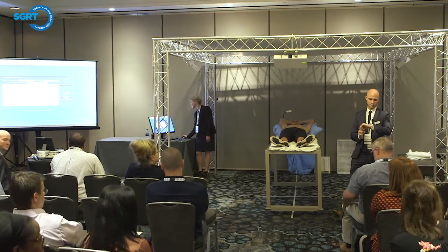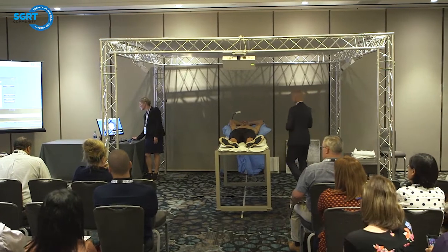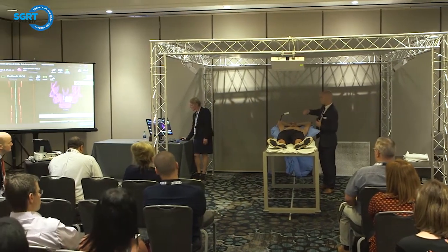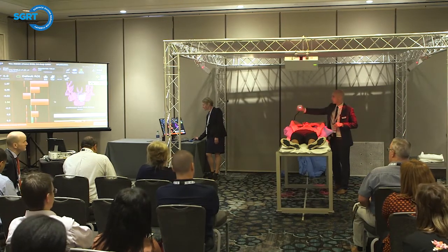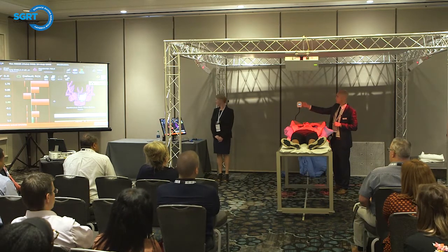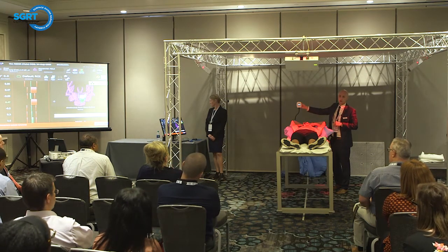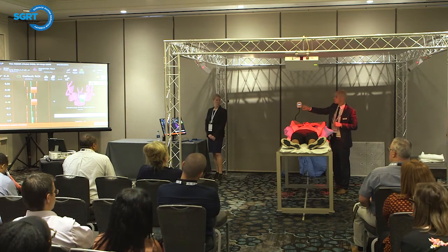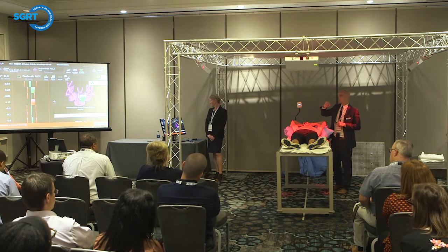Yeah? What does it look like on the monitor for the patient? Yeah, that's a good question. So let's pull that up so you can see it. So we'll go ahead and begin monitoring. That 2D plotter at the bottom here is actually replicated on here for the patient to see. So go ahead and take a breath in. I don't know if you can see that colored bar come up. Okay? So that's how the patient is going to know exactly how much breath they need to take in. They're trying to reach that vertical mark, which is set by their ISO center they achieved in SIM.